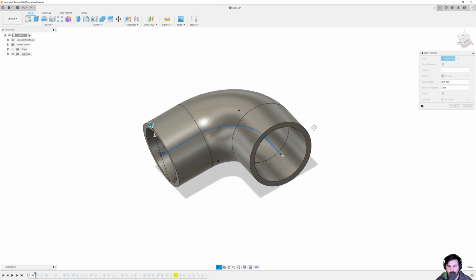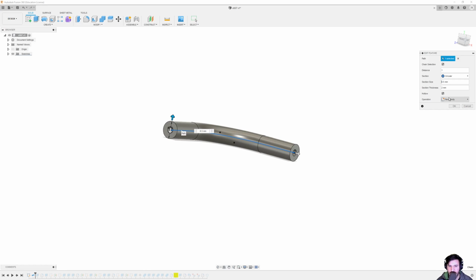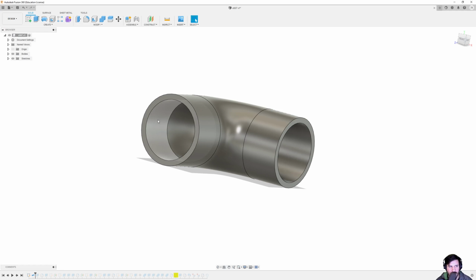The important part for this piece is this inside diameter here, because that is what actually had to interface with something. So when I change this section size here, if I went down to 6 millimeters, you can see that internal diameter changes, but the external doesn't. That thickness is still 2 millimeters. So that inside piece is really the most important part of this.